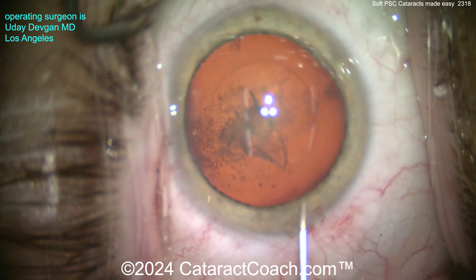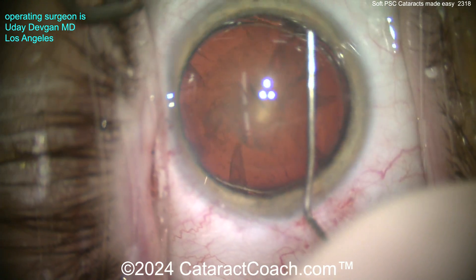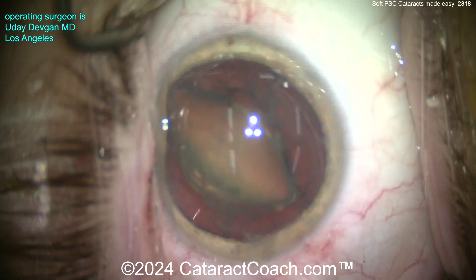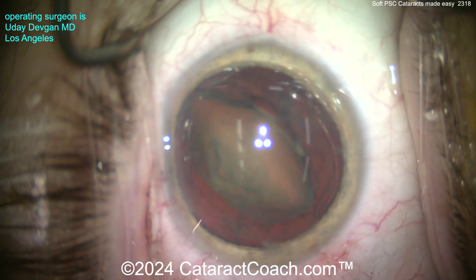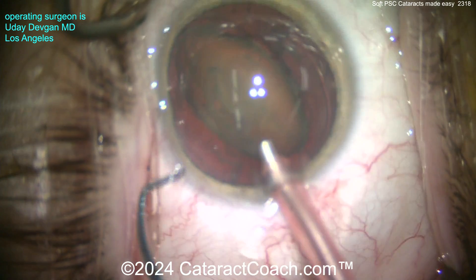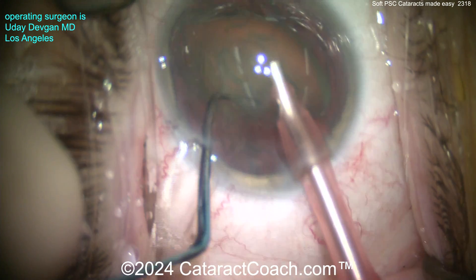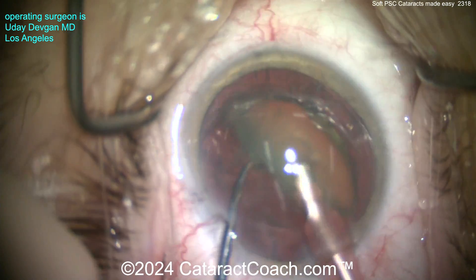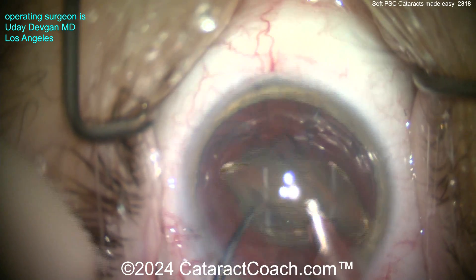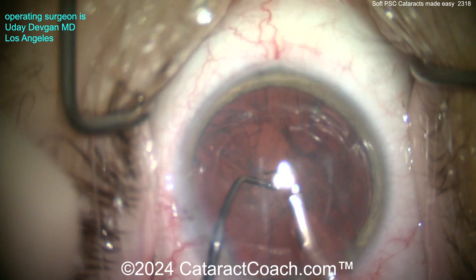Here's the trick in the whole case — it's the hydrodissection. BSS on a 27 gauge cannula, nice and easy, get that nucleus out of the bag. You don't want this lens in the bag. Going in with the phaco probe on a high vacuum, high flow setting — at least 300 to 400 millimeters of mercury and at least 30 to 40 cc's a minute of flow. You can see this is just short work; you don't need to even sub-chop this. It can just be aspirated pretty easily — it just comes out fast.